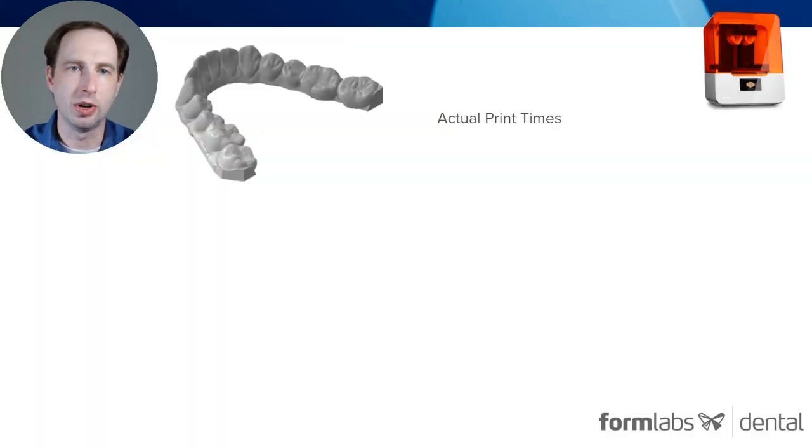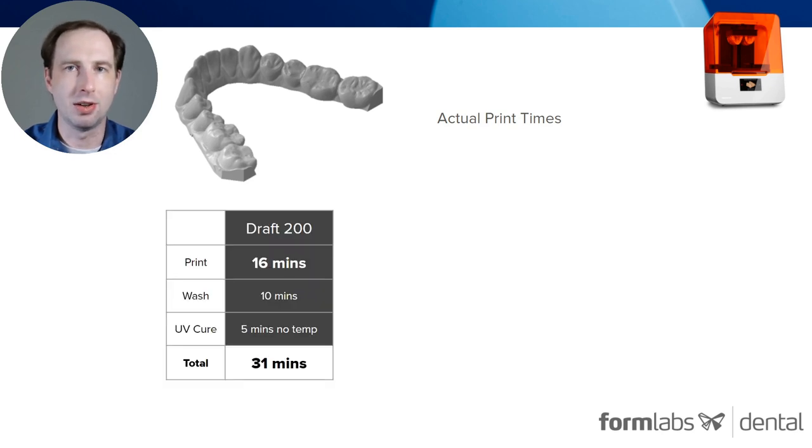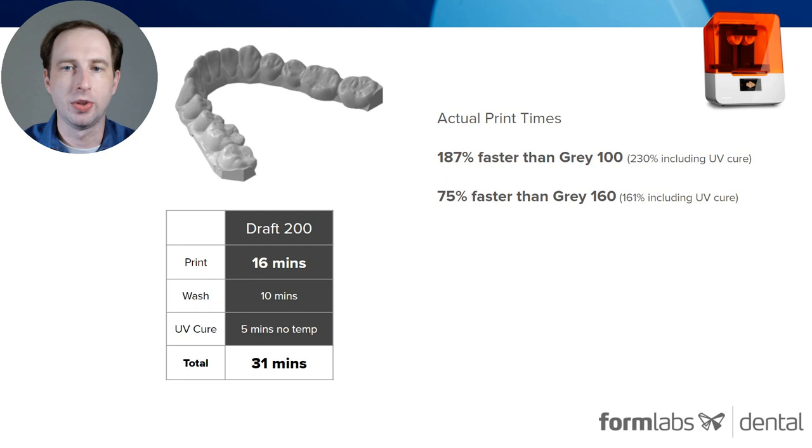First, if you were doing a really short based rush case model, just one, it prints in 200 microns in 16 minutes. It only takes 5 minutes of UV curing with no heat, meaning the arch will be ready to use in 31 minutes. Staggeringly, it is 75% faster than Gray 160, our previous fast model setting. And if you include UV cure time, it's actually 161% faster total time.